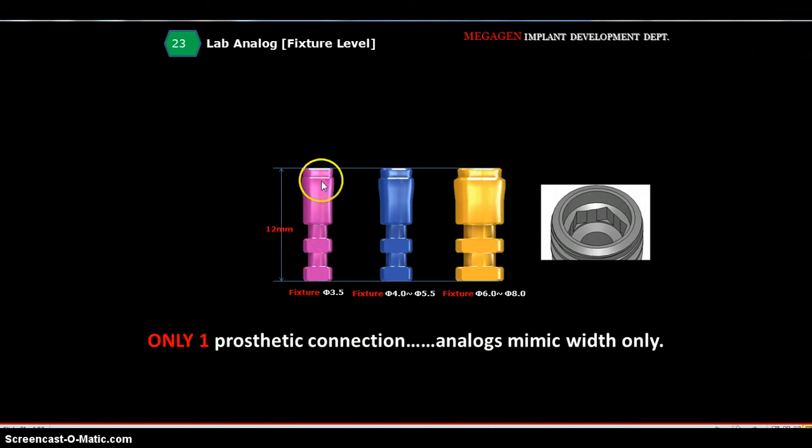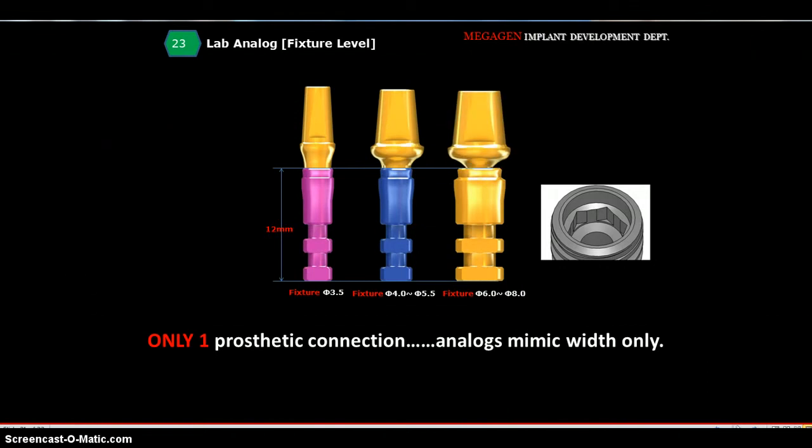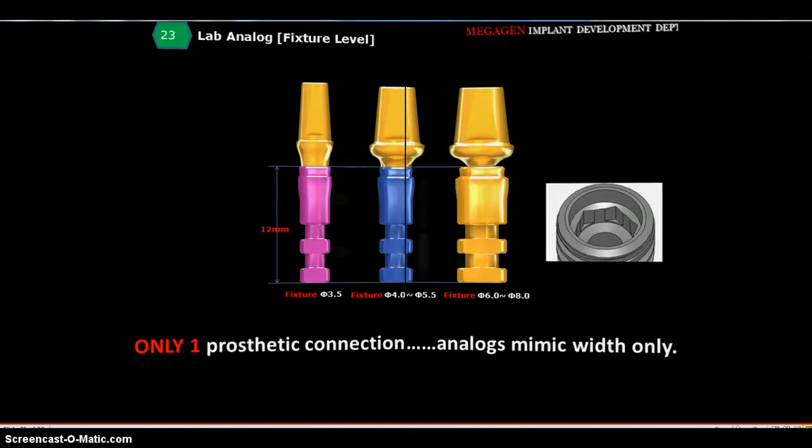So that's why we have your 3 different widths of analogs. Your small, medium for blue, and large for yellow. So 4.0 through 5.5 is typically going to be blue, 3.5 is going to be purple, and 6.0 through 8.0 is going to be yellow. There's your 4mm abutment, 5mm abutment for the blue, as well as 6mm abutment for the blue, and your 7mm abutment for your yellow analog.